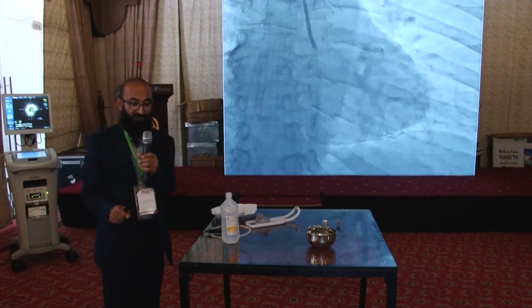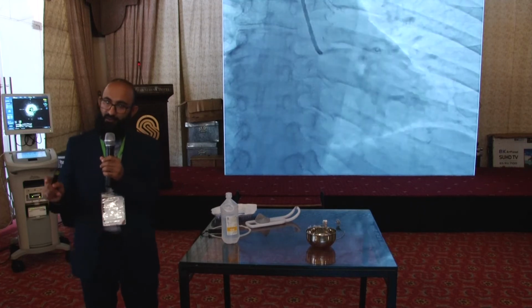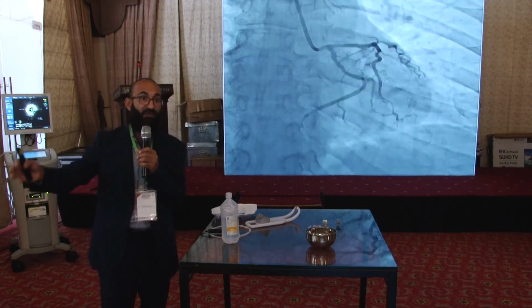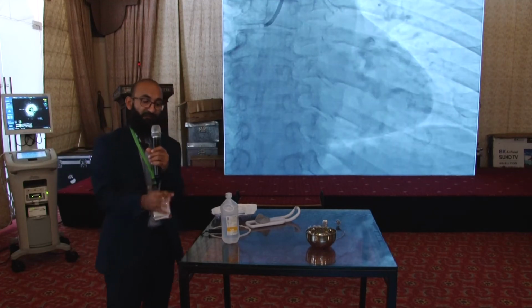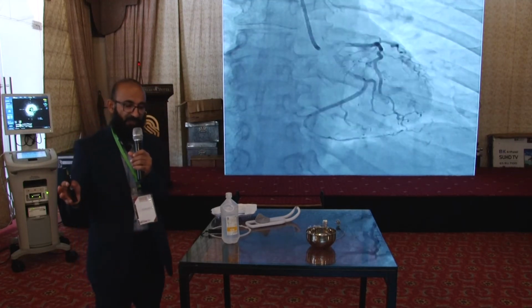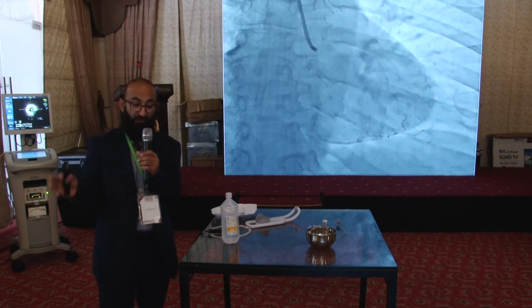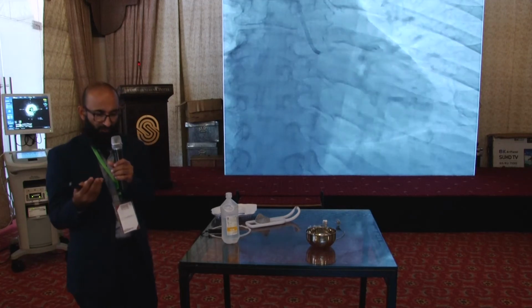Okay, this is a very good case. This was a lady who is hypertensive. She was referred from another center by a surgeon as well as by a cardiologist for assessment of the left main. She had a previous stent placement 5 years ago, in 2017, and she had symptoms of angina on exertion.